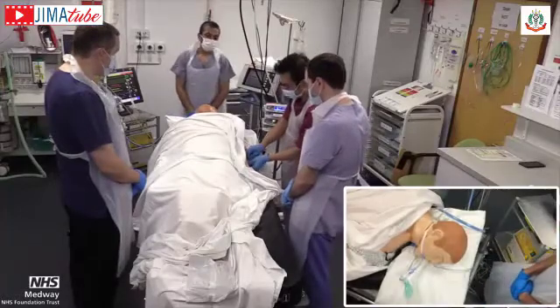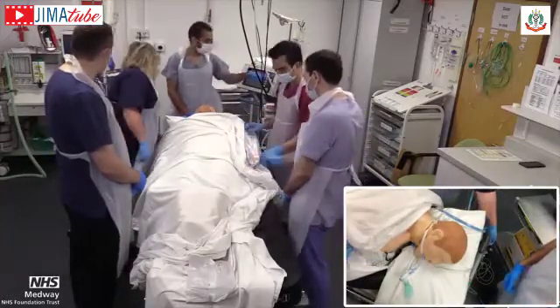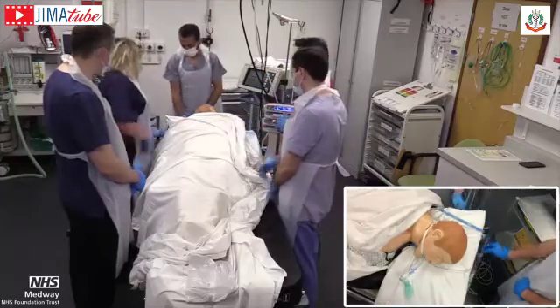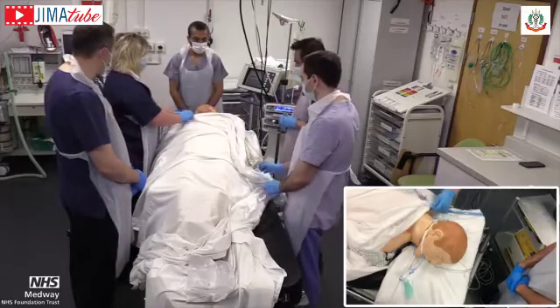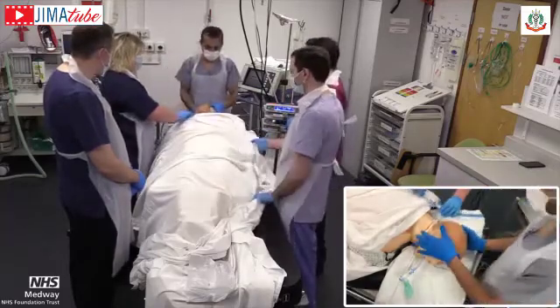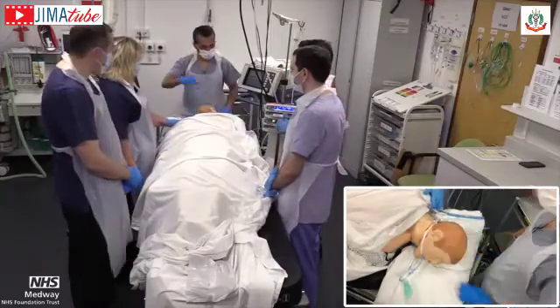Once you attach the arterial line, it's always good to re-zero that as well, which we can do quite easily. And with this, Vipul, do you have to mention anything about the arm position? So we can put both the arms up if the neck is neutral, but now the head is on one side, so we keep it as a swimmer position.